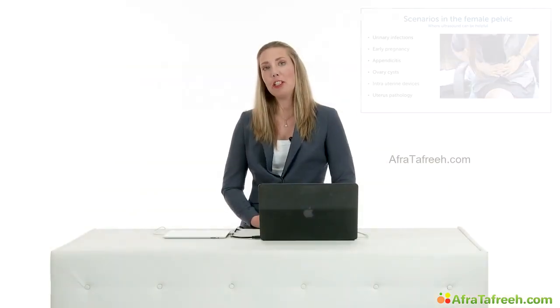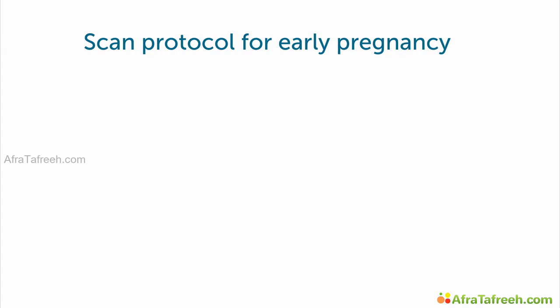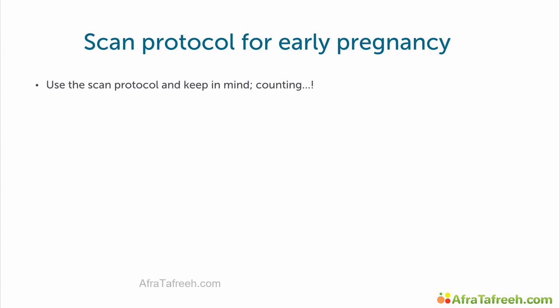There are different scenarios in the female pelvis that we can come across, but today we will focus on early pregnancy. I would like to introduce you to my scan protocol for early pregnancy. What I found is very important in this protocol is the counting.